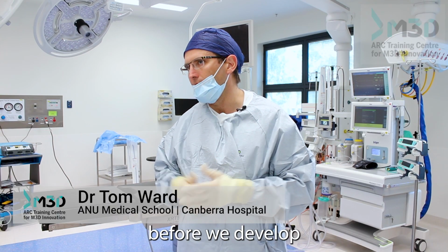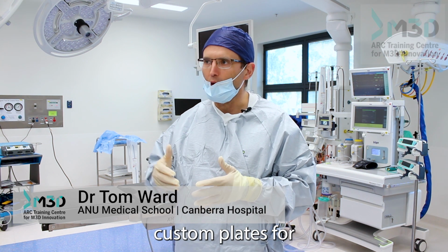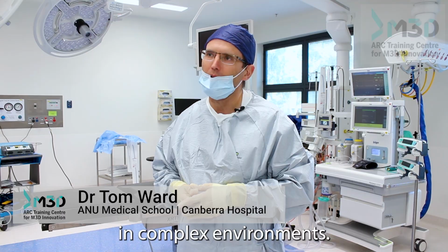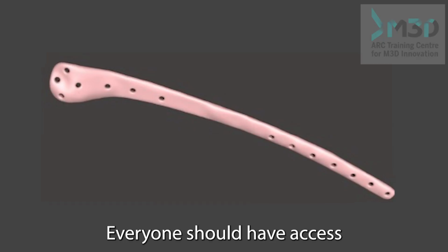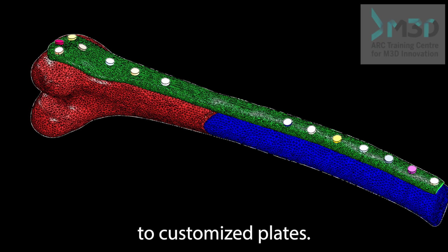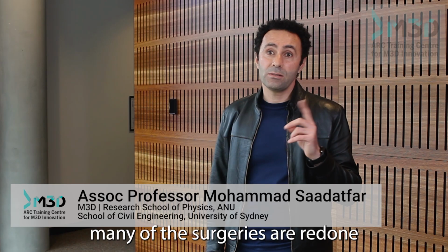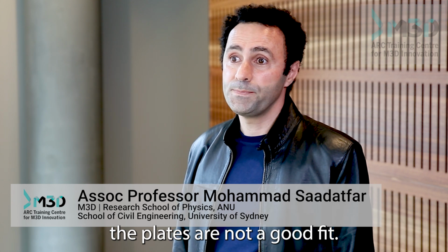It's only a matter of time before we develop custom plates for a lot more patients, in particular in complex environments. Everyone should have access to customized plates. I was talking to Tom, the surgeon. He said many of the surgeries are redone. This is incredible, because it's primarily because the plates are not a good fit.